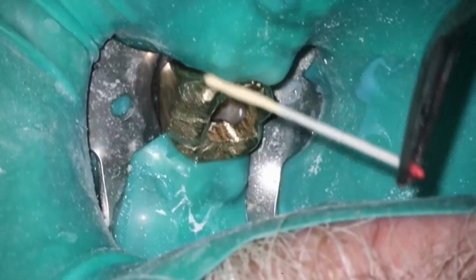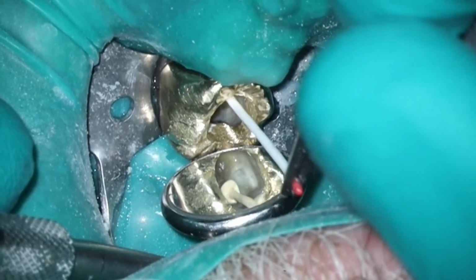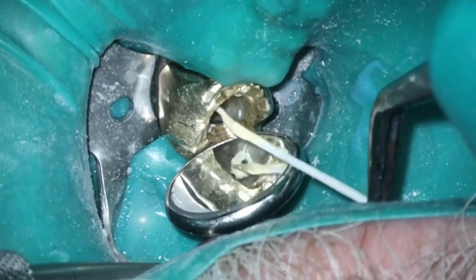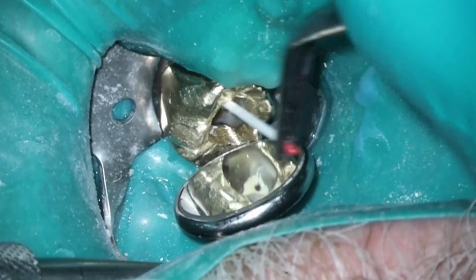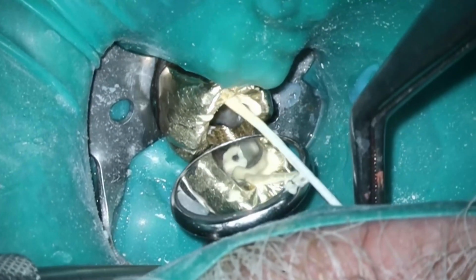Anyway, what's going to happen here is when I go back down with my K files, I'm not able to get all the way to length on the mesials. We were a little bit short there. They didn't join, so I'm not sure why there was some difficulty there. Generally with the gentle wave, it's going to remove any impediments very nicely, but you'll see here in a second after I get the sealer in that we were definitely short initially.